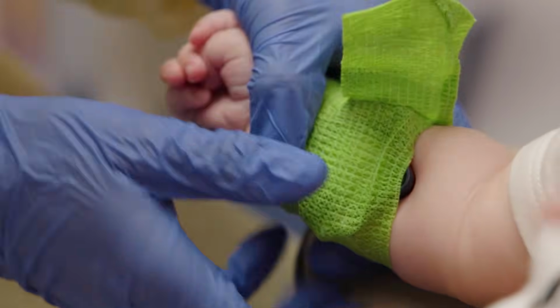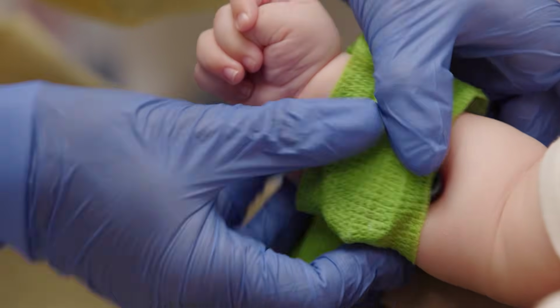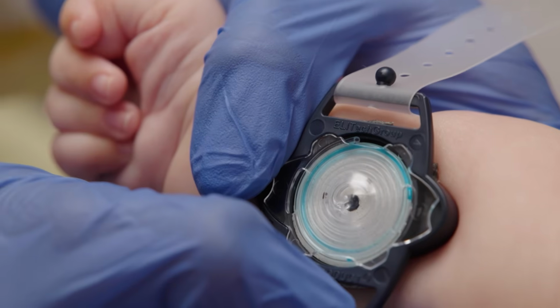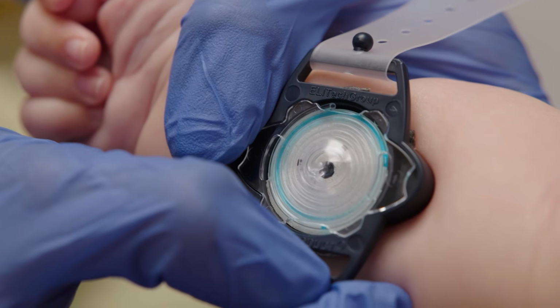Sweat should be collected for no more than 30 minutes. If sweat is approaching the end of the coil, the collection can be stopped early. Be sure the sweat does not reach the end of the tubing or overflow.